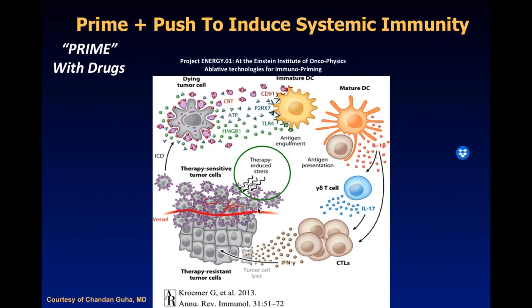And with brachytherapy, we will not cause a loss of those T cells as we would perhaps expect to see in the external beam, when you've got beams that are coming in and wiping out your lymphocytes. And we know through surgical data that 15 to 20% of these intermediate risk patients should have positive lymph nodes, but we are not seeing failures. So this provides us an opportunity to incorporate immune modulators, anything from PD-1 to other types of checkpoint inhibitors.